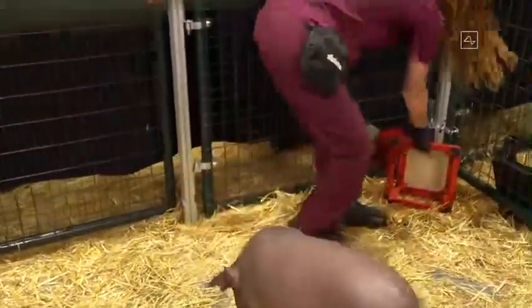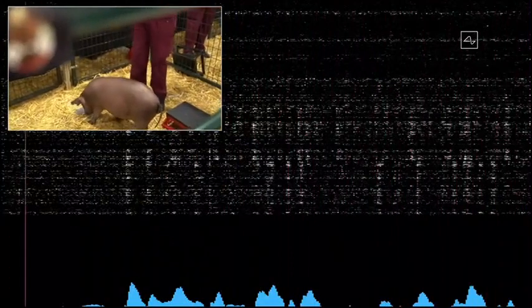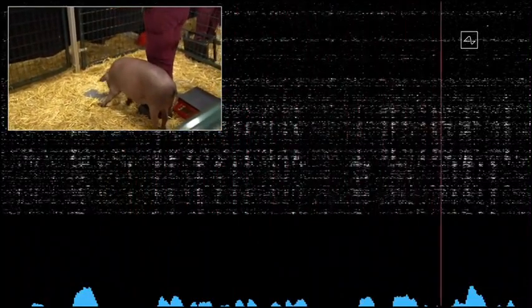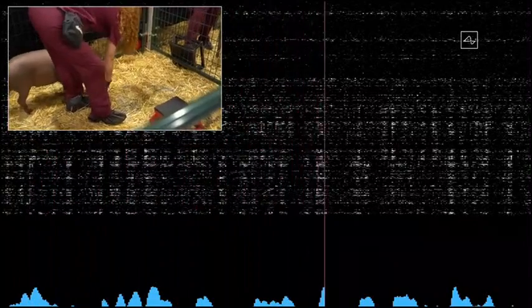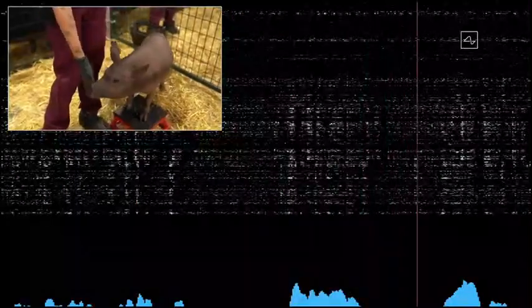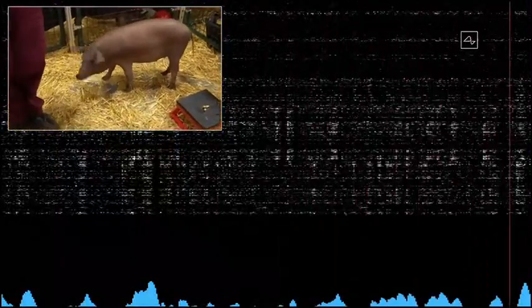Okay, this is a high energy pig. All right, Gertrude, thanks for coming out. So the beeps you're hearing are real-time signals from the Neuralink in Gertrude's head. This Neuralink connects to neurons in her snout. Whenever she snuffles around and touches something with her snout, that sends out neural spikes, which are detected here. On the screen, you can see each of the spikes from the 1,024 electrodes. If she touches her snout to the ground, or you feed her some food, pigs love food, then you can see the neurons fire much more than when you're not touching the snout. And that's what's making the beeping sound.